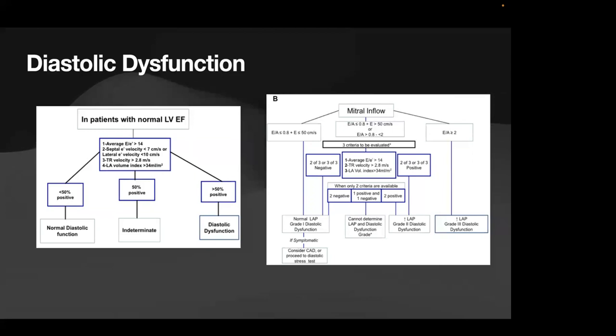That being said, it's not the most validated way to do that, because we're starting from a position where we're saying, I don't know what the left atrial filling pressure is, but I'm going to ignore that and look at the transmitral flow and make an assessment. So there are caveats to that.